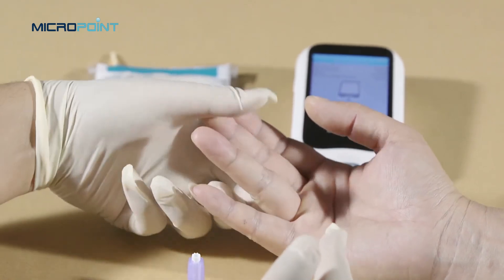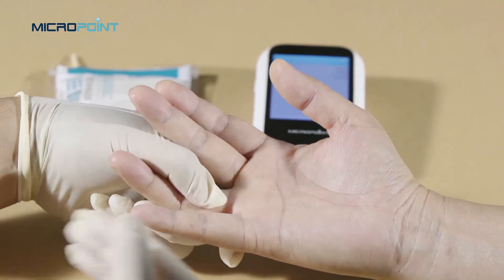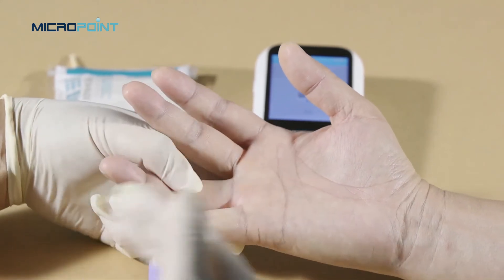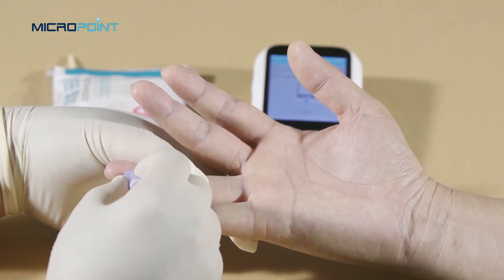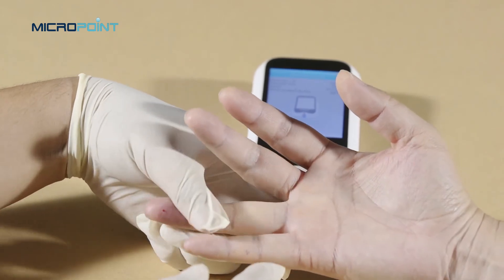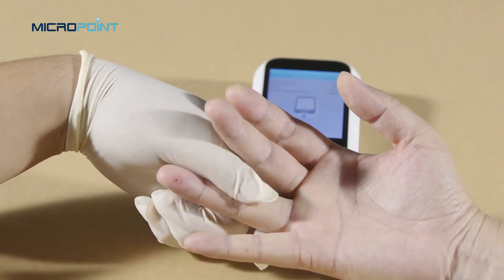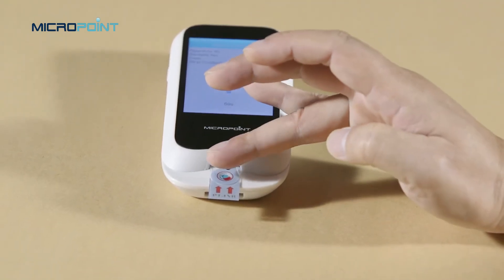Wait to puncture until the heat-up is over and the 120-second countdown begins. Clean the selected area with an alcohol pad and dry thoroughly with cotton or gauze. Puncture the finger with the lancet. Apply gentle, continuous pressure until a large, hanging drop of blood forms.